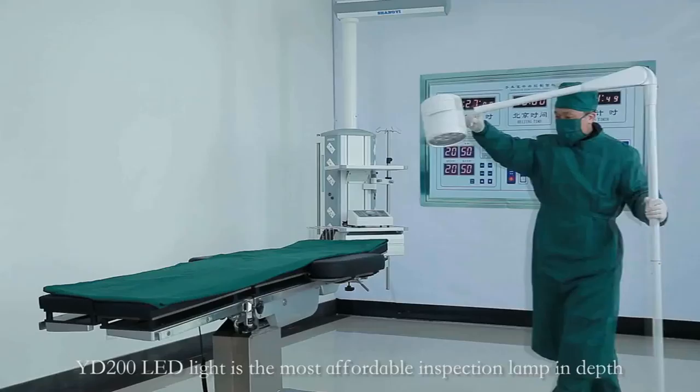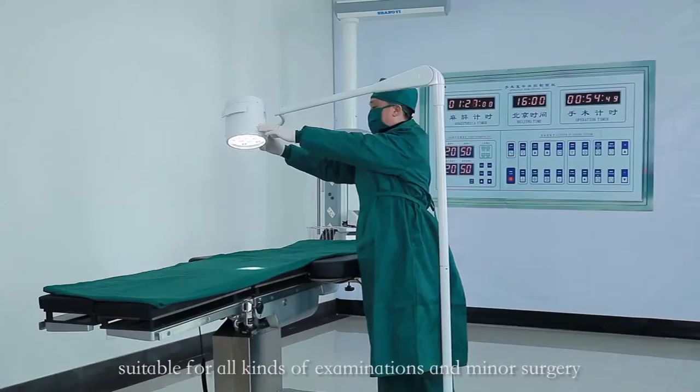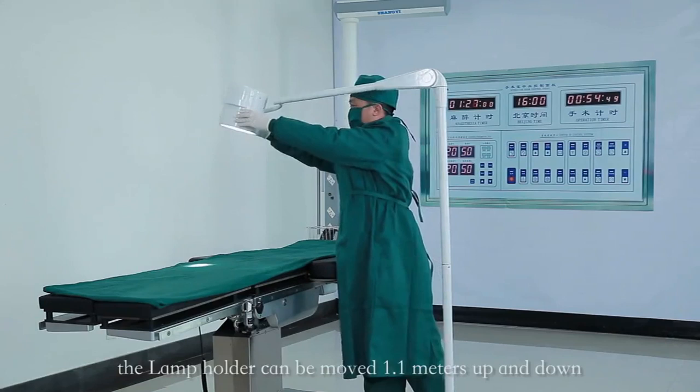The YD200 LED light is the most affordable inspection lamp in depth, suitable for all kinds of examinations and minor surgery. The lamp holder can be moved 1.1 meters up and down, and rotated 220 degrees left and right.